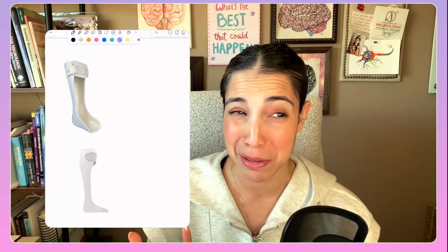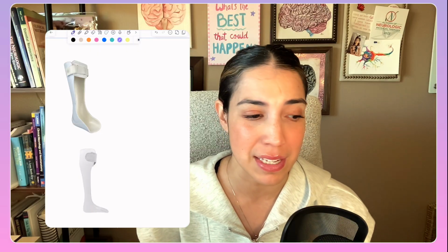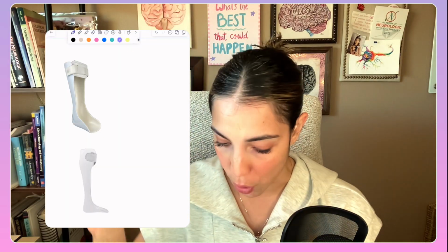So, AFOs are primarily used for people who can stabilize their knees in stance, but need some control at the ankles. That's why they're called AFOs, ankle foot orthosis. Now, we are going to start our AFO series. It is a topic that is a little overwhelming because there are so many types and so many purposes, so I'm going to try and simplify this.